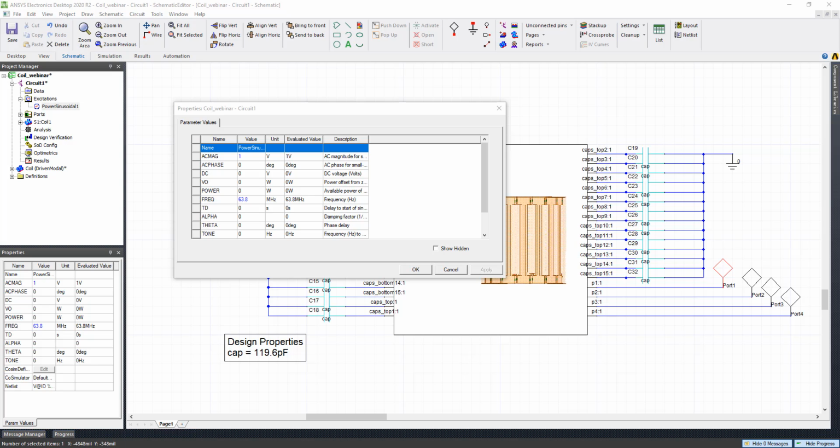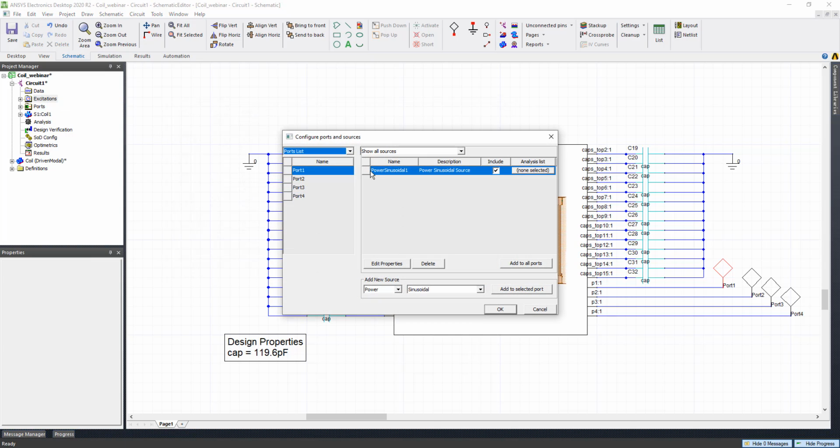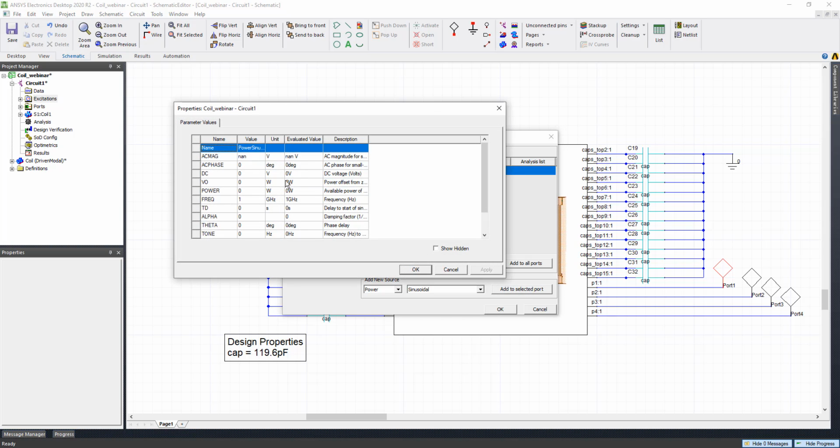All right. Yeah. So I want to create multiple ones, and let them have different phases. So I should have this one, and I should add another one. Okay, can I copy? No copy for this. So I just add another port, also 40, and this time I want to give it a 90-degree phase difference.